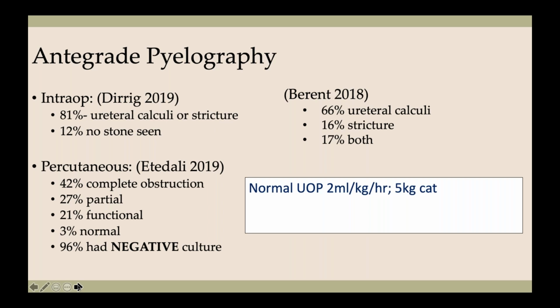One thing I want to point out is when we're doing pyelograms, the way that most people do it is you'll put the needle into the renal pelvis, you'll aspirate some volume, and you usually give maybe half or maybe up to that volume back with your contrast.